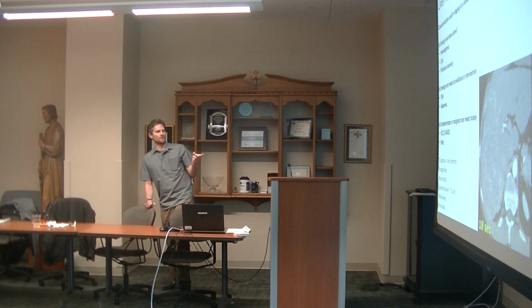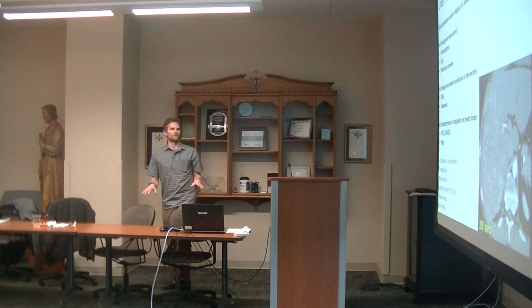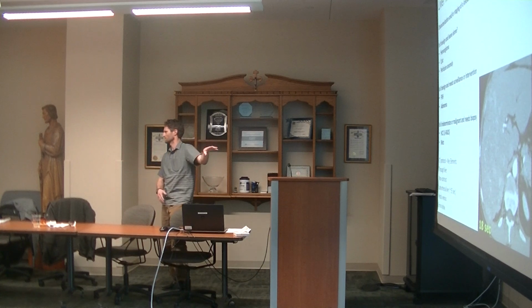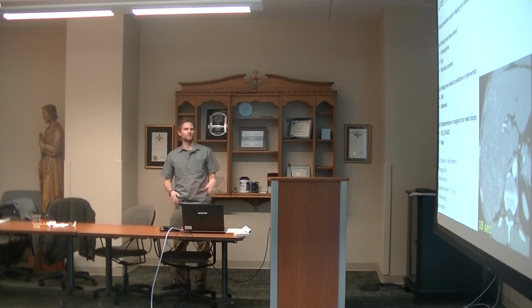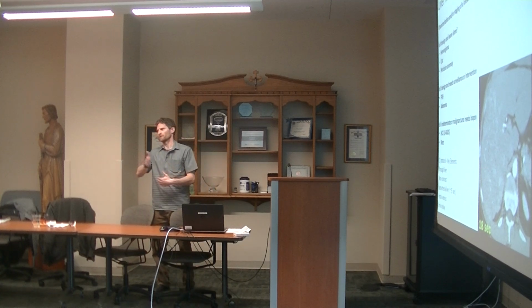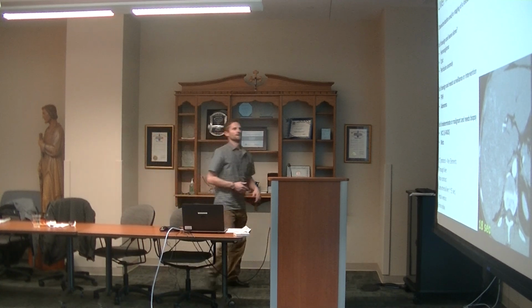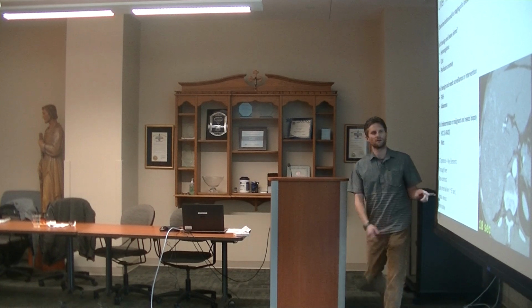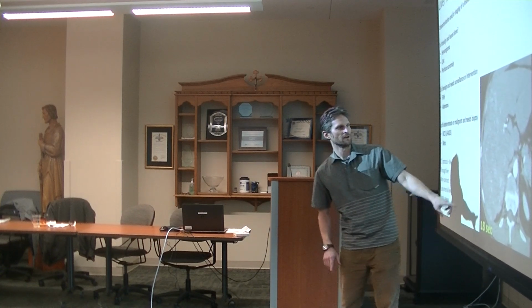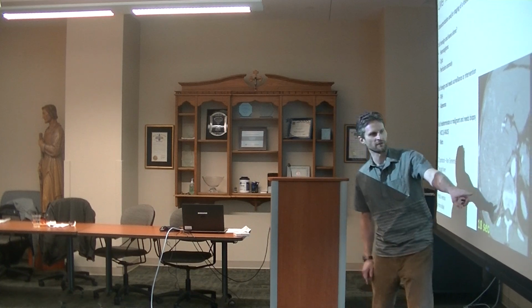Again, through the liver, there was like the hemangioma one, and I think we can just do this one. We'll do the non-con, the late arterial, which is a little bit earlier than the pancreas late arterial. And this is sort of the difference of why it's critical to get a good late arterial phase image. If you look at this exam, this is sort of in that early arterial.